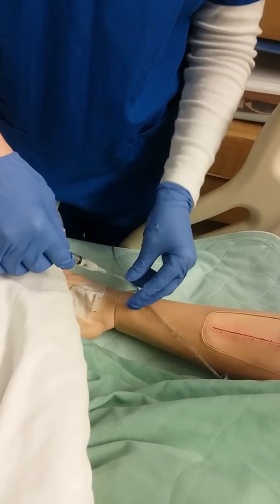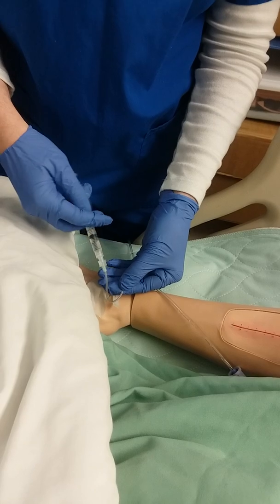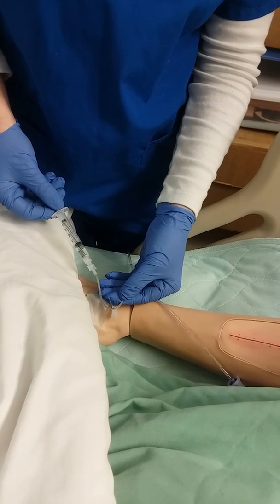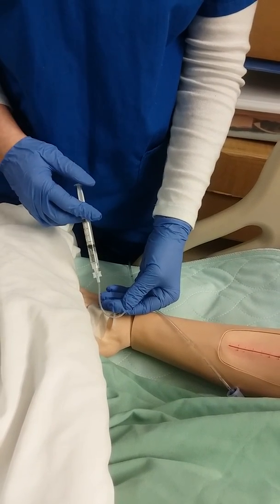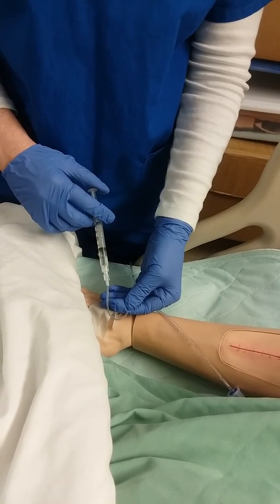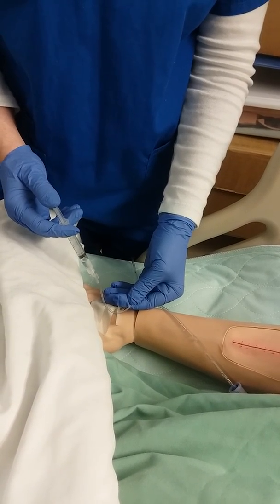And then I'm going to move my fingers closest to the site, and I'm just going to put the tubing between my fingers so that I can hold it steady. I'm going to pull back on my plunger just until I get blood in the tubing. And then I'm going to inject my medication at the appropriate rate, which would be 6 seconds per line, making sure to administer the medication with a steady and continuous flow.